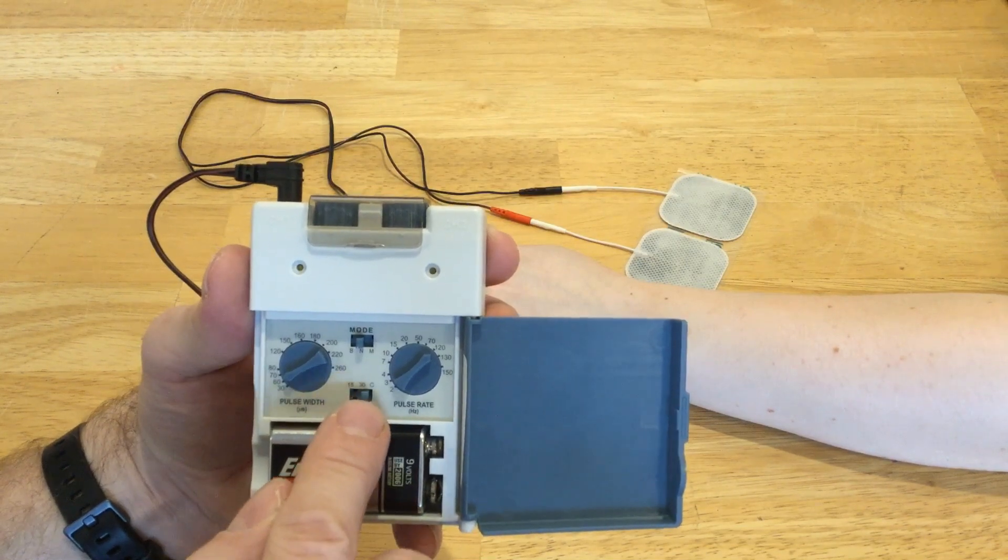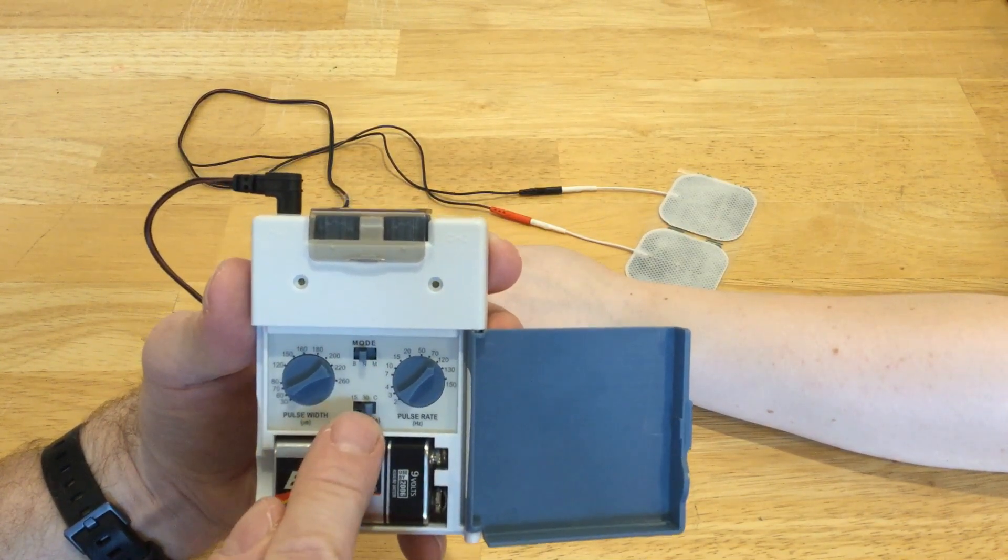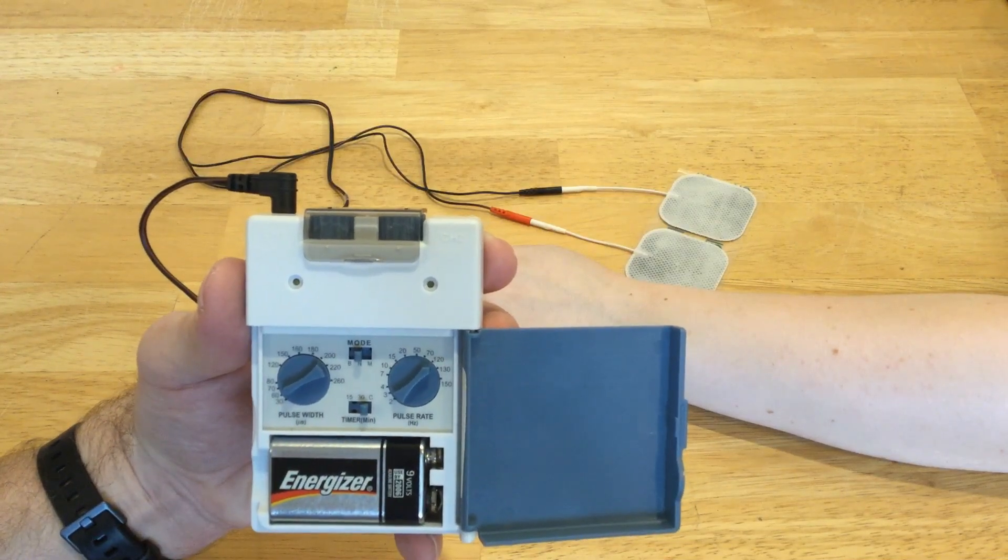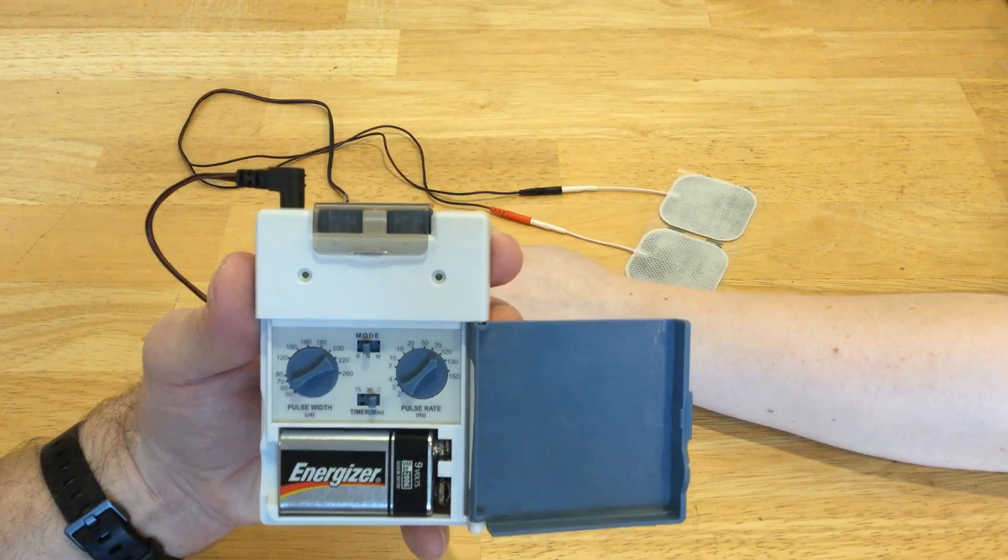As far as the timer goes, it's C for continuous, which is what I have it set at. Or the 30 would shut off after 30 minutes, or the 15 would shut off after 15 minutes.